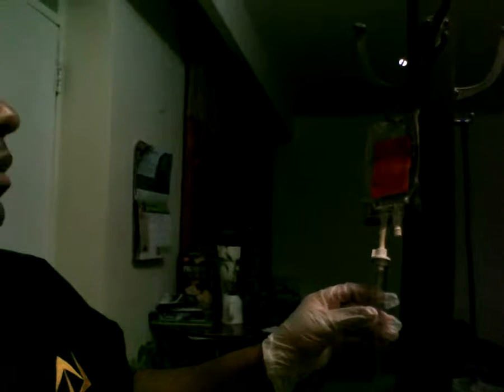Okay. And already, like I said, this is my fourth. We already did the fourth check. Everything, medications, is running on. So now I'm going to check with my patient, Mr. Tutu. Hello, Mr. Tutu. How are you doing? I hope everything's fine. You have any pain? No? Okay, you're great. Okay, please let me know if you have any pain, or I will check it out.